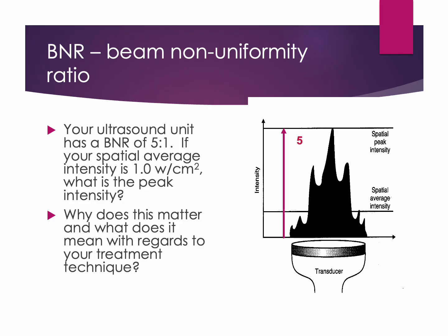This matters because higher peaks increase the risk of tissue damage via burns. This is the primary reason why we keep the sound head moving during an ultrasound treatment. We want the hotspot dispersed, not left in one area to cause a burn.